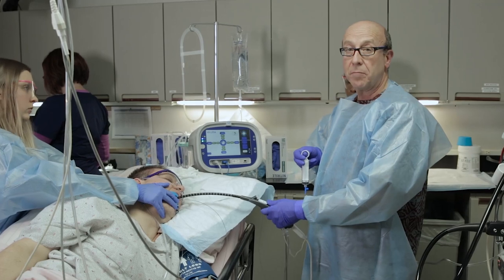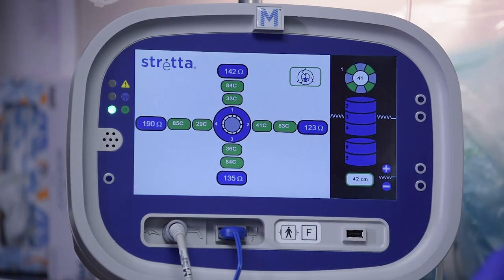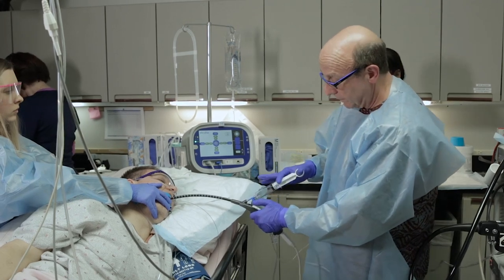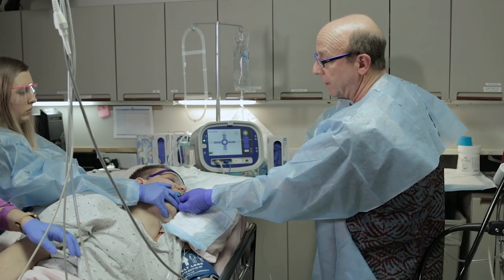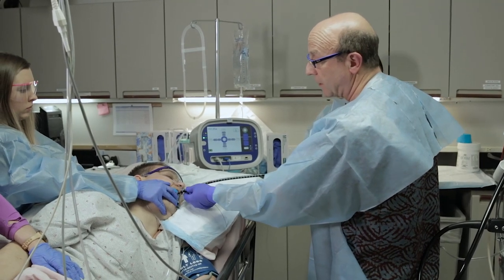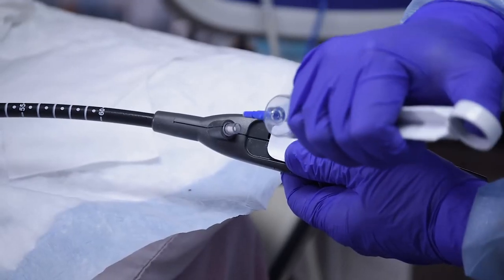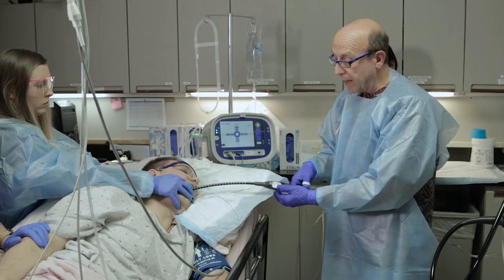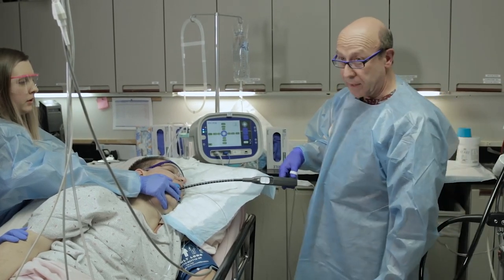That temperature range is important because as long as it stays within that range, you can't cause burning or destruction of the tissue — so there's no scar tissue, but rather just a stimulating effect on the tissue itself. That's really what the Stretta procedure does: it stimulates the muscle to grow. At the end of a one-minute period, the machine signals it's done. We pull the needles back, remove the air from the balloon, retract the catheter up to the first metal band to remove any remaining fluid, then reintroduce it, rotating 45 degrees, and begin the next treatment.